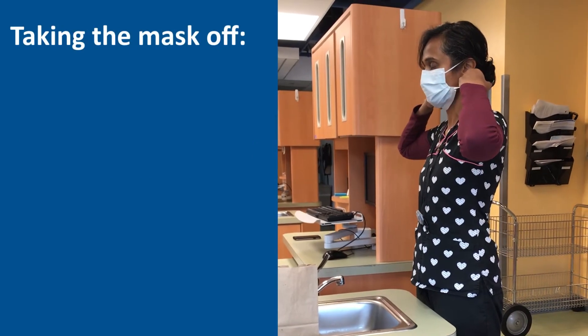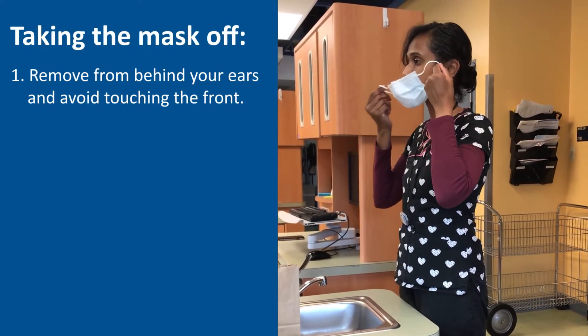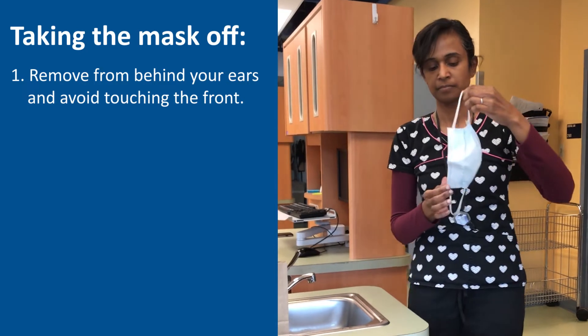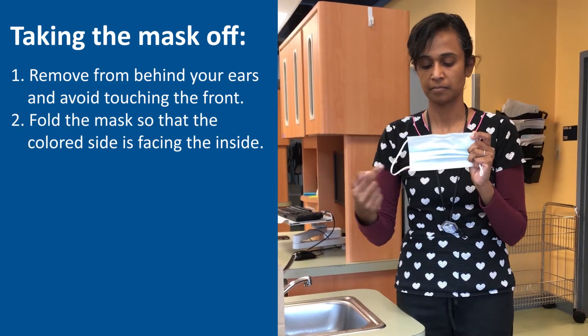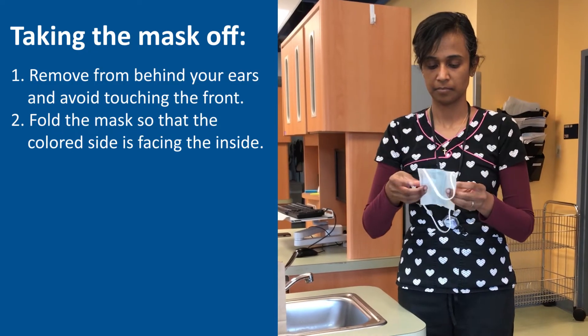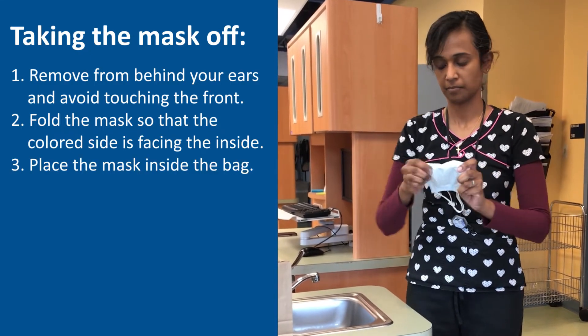Now to take the mask off, remove it from behind your ears and do not touch the front. Fold it so that the colored side is facing the inside of the fold, then place the mask in a paper bag.